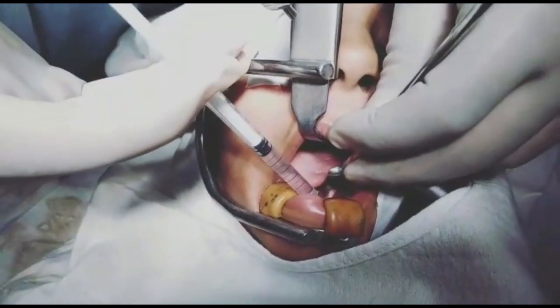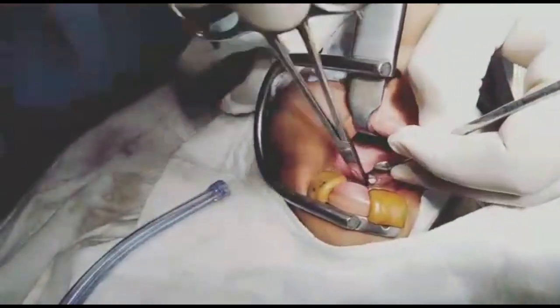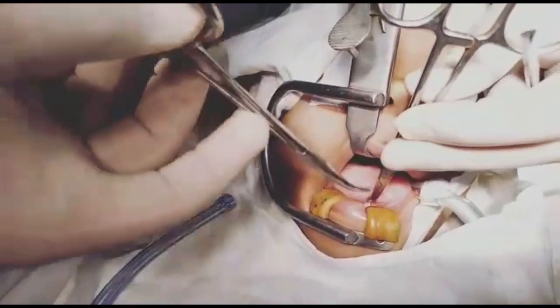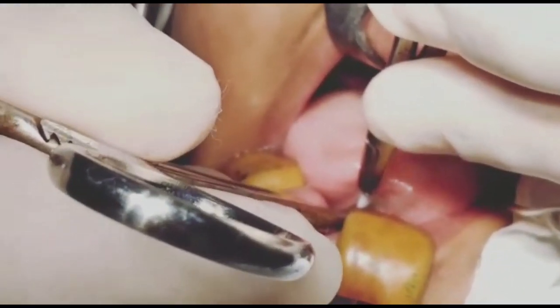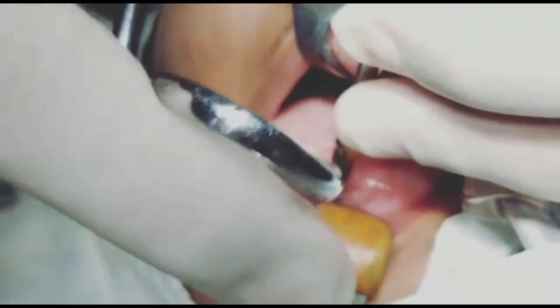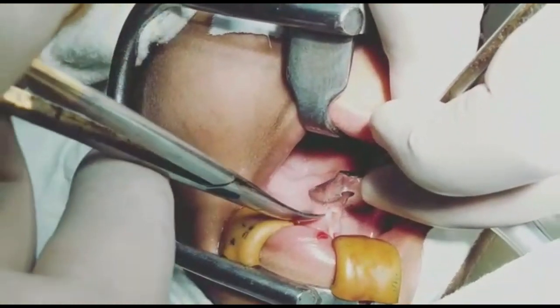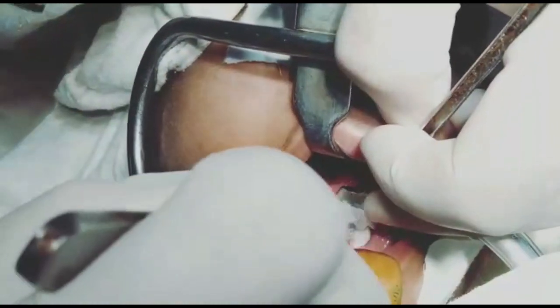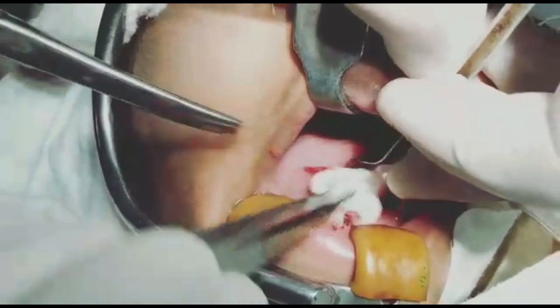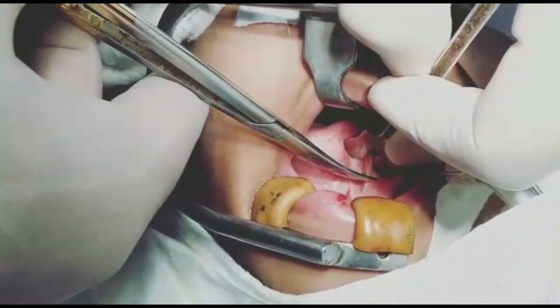Here I am infiltrating local anesthesia. Afterwards, I apply hemostats. Then I cut the frenulum with sharp-edged scissors, and use my finger to penetrate the frenulum. The tongue has to be adequately released, so some portion of the muscles is also cut out.